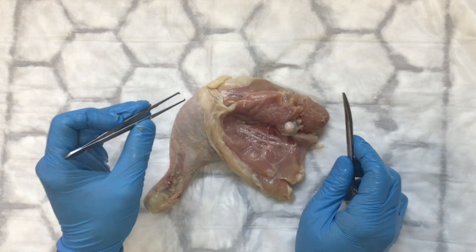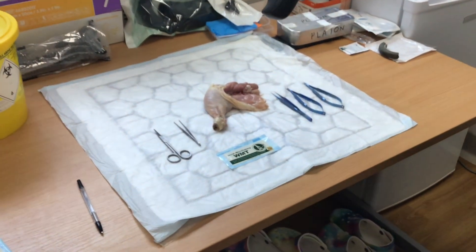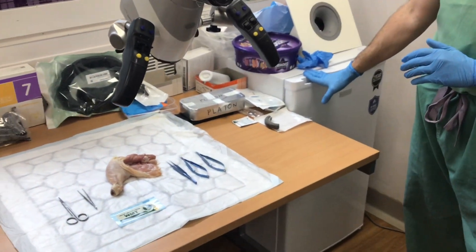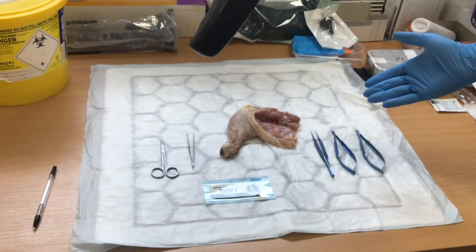We can now look at that under the microscope. In a separate video we've demonstrated how to prepare the chicken thigh, but now I'm going to talk about how to use the microscope and some of the key principles. We have the microscope in position and the fridge here where we can store the chicken thighs. These chicken thighs can be frozen, defrosted, and then prepared as we have done here.